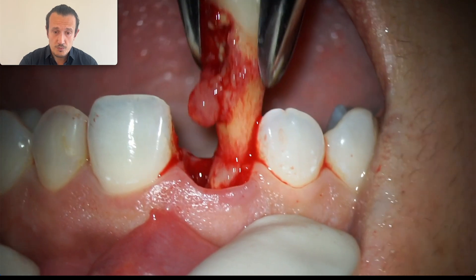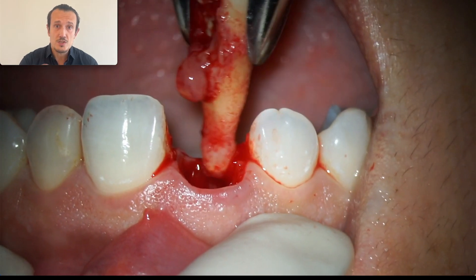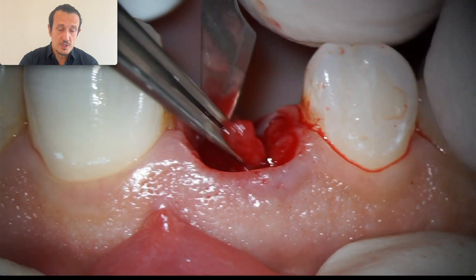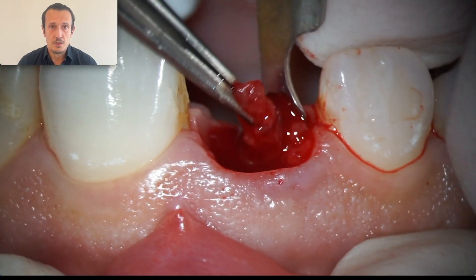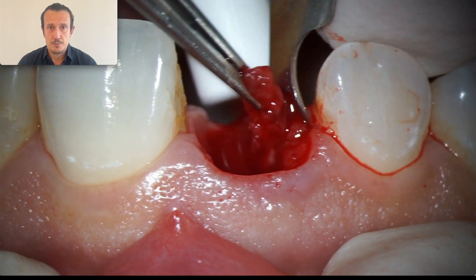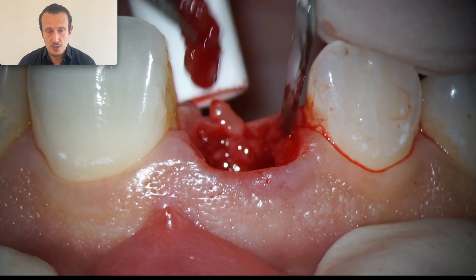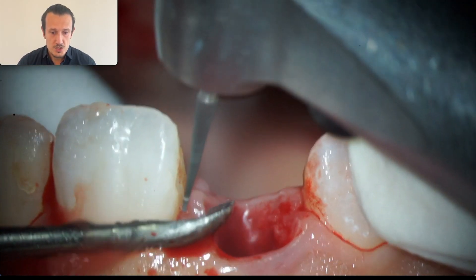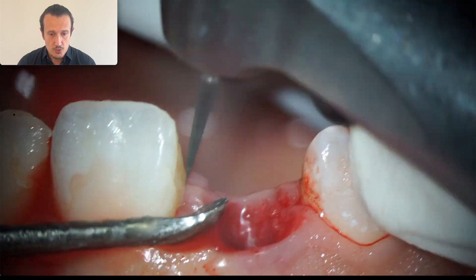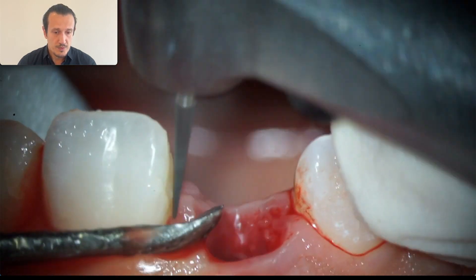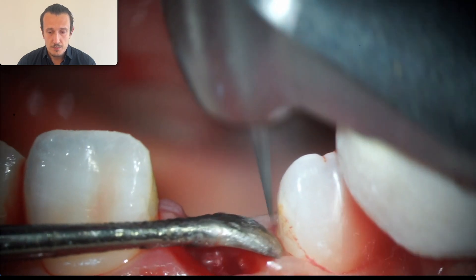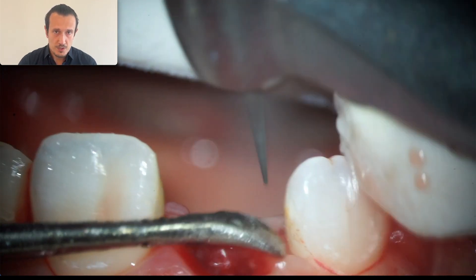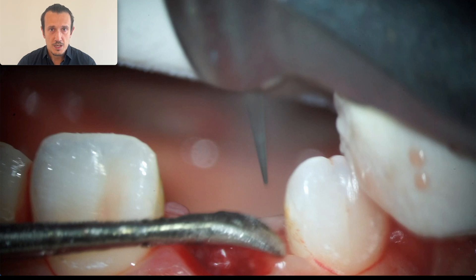You can see here how much soft tissue is attached to the root — we need to clean the socket a lot. It's not like a regular socket; there is a lot of soft tissue that in my opinion we should remove. Additionally, I'm going to reshape the composites here — I didn't know about this before the surgery, but I saw it during the surgery and immediately corrected it with a small burr.